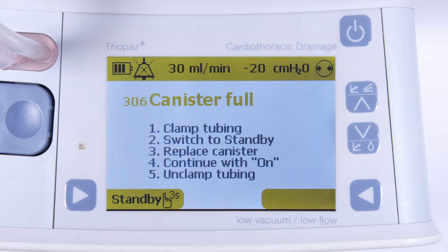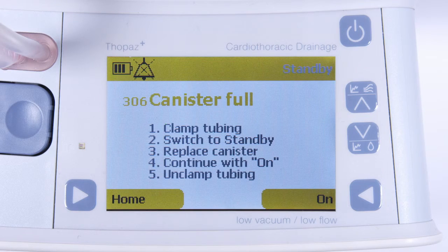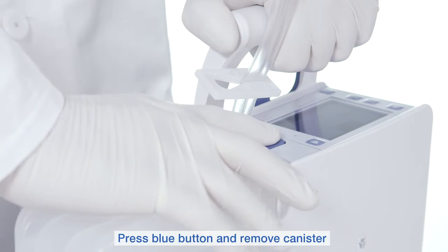Put Topaz Plus in standby mode by holding down the standby button for 3 seconds. Press the blue button and remove the canister.